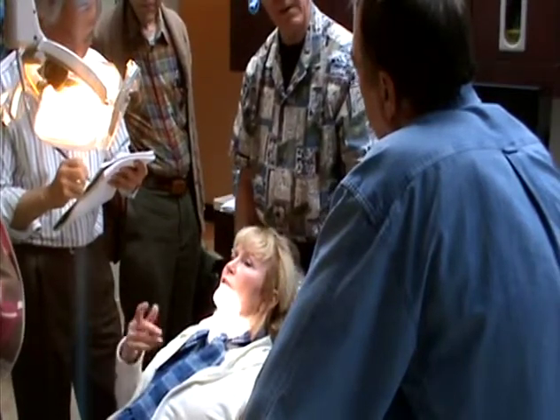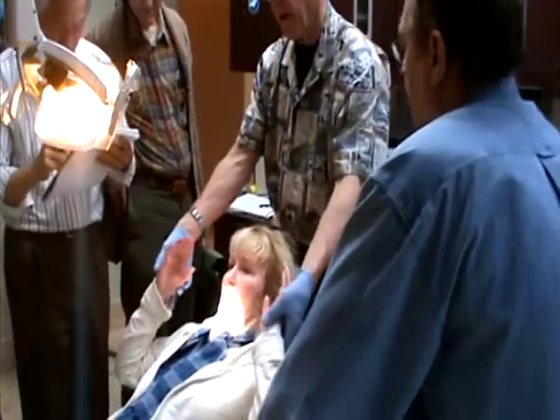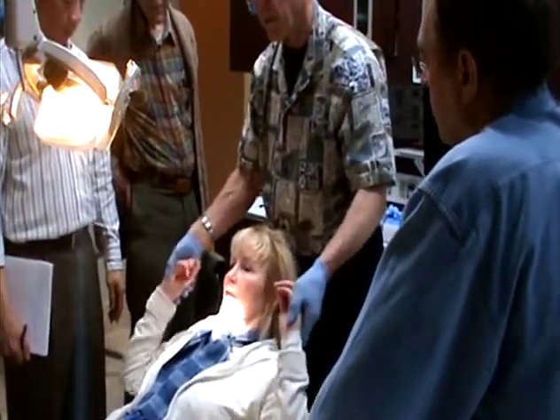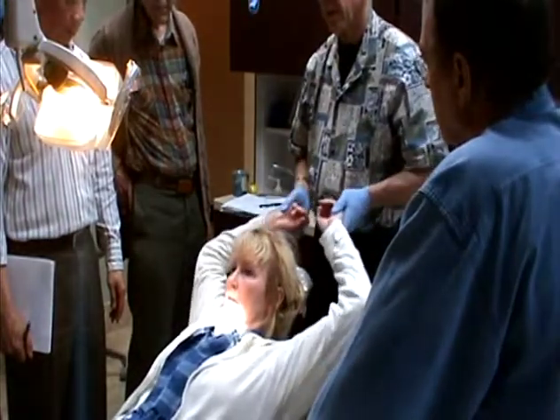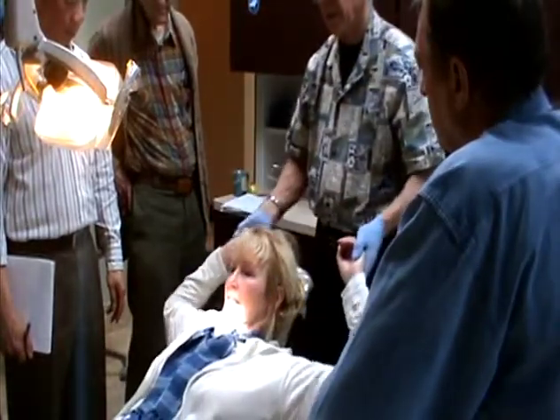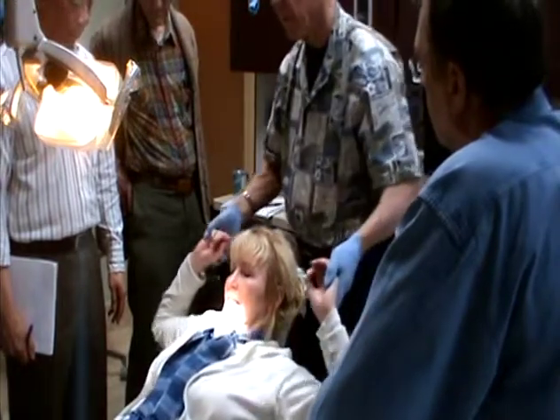Now, can you test me and see if this is all right? Yeah, give me a minute. Open your mouth a little bit, and just relax, nice and relaxed, real floppy, there you go. Okay, bite your teeth together, and relax a little bit. Yeah, that's really suitable for right now.